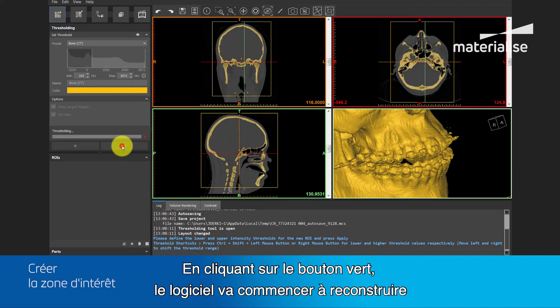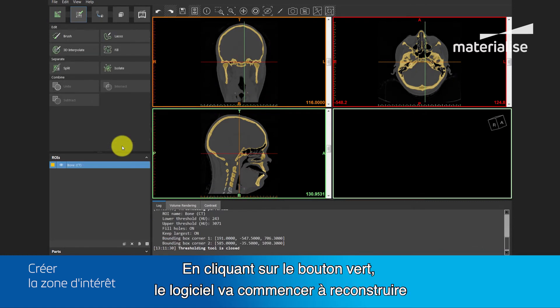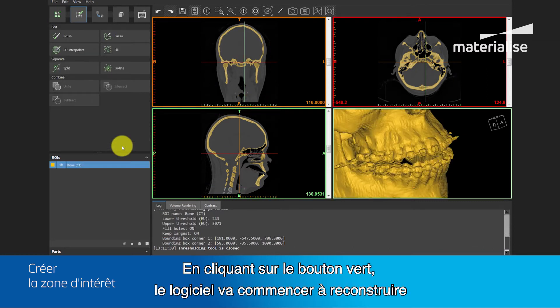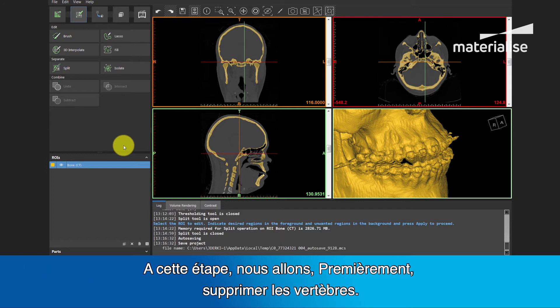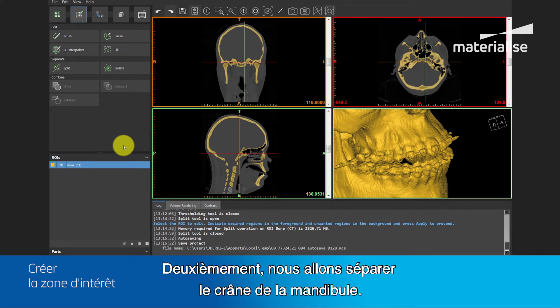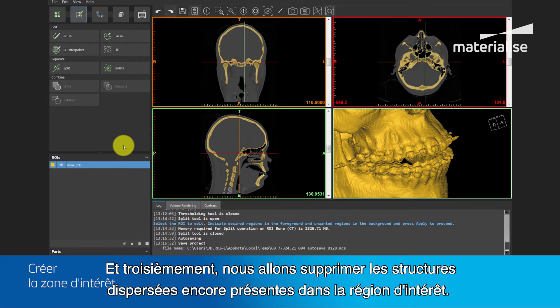I will also check Fill Holes, because you can see that some of the trabecular bone is not fully within my threshold value, and by checking this box, those tiny holes will be filled. By clicking on the green button, the software will start constructing this region of interest. In this step, we want to: first, delete the vertebra; second, separate the cranium from the mandible; and third, delete some of the scatter still present in the region of interest.